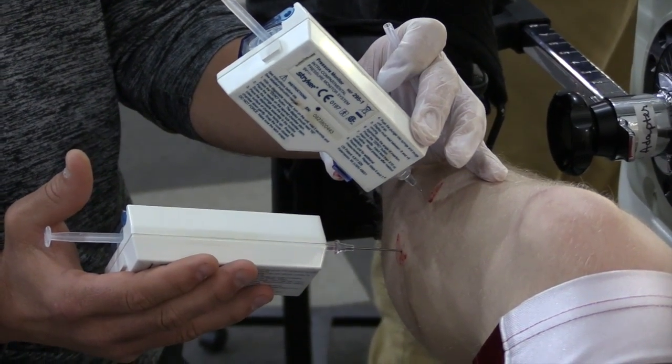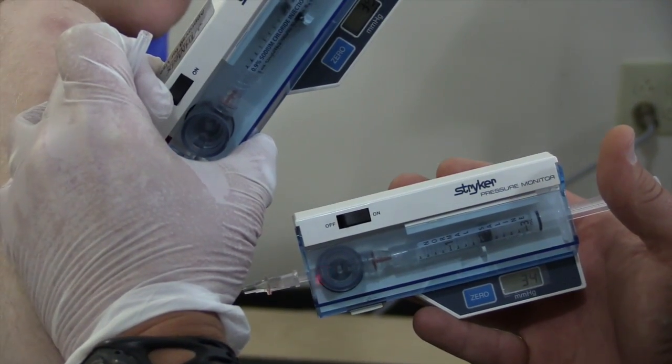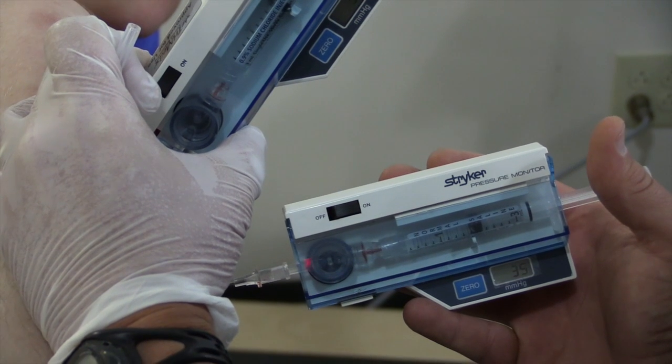There are times we will repeat this exact process on the opposite side if someone is having bilateral complaints.